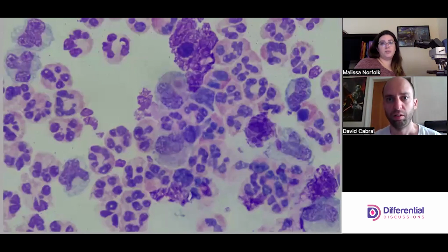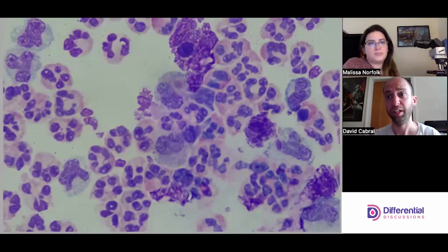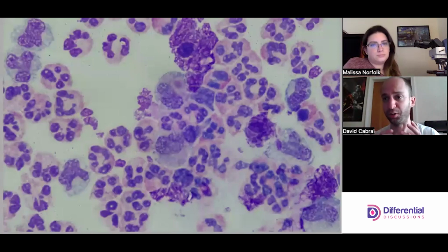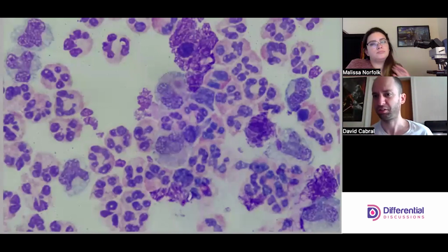So, first thing that I want to point out is that these are not eosinophils. So you might see, as the viewer, the color is not quite neutrophil color. Part of that is how the stain behaves based on the pH of the fluid. When it comes to blood, the pH range is very tightly homeostatically controlled, so we get very consistent coloration and staining. What you'll see in body fluids is that they could be bluer, or more devoid of color, like maybe lighter. CSFs tend to not have as much color pop to them.